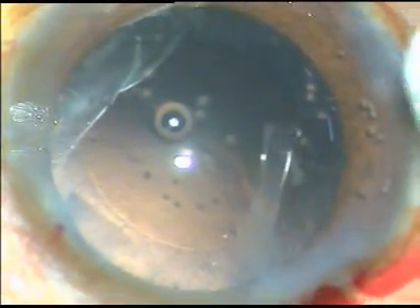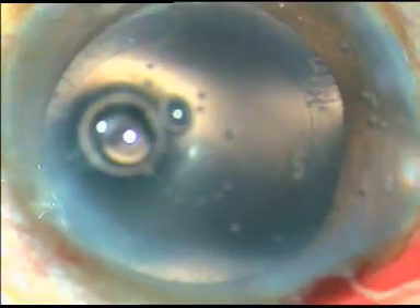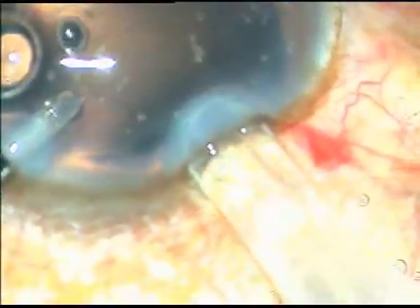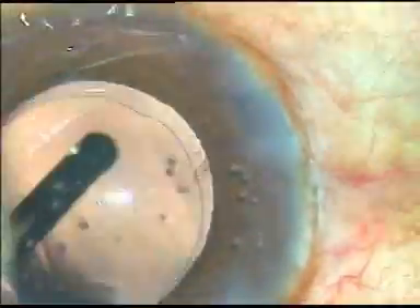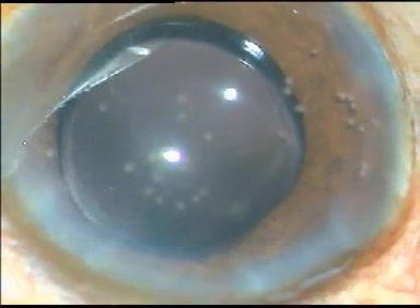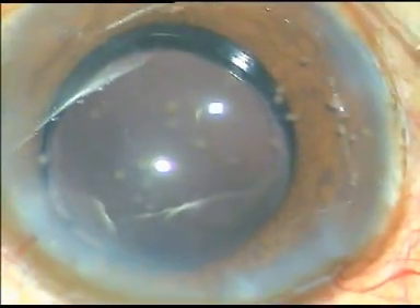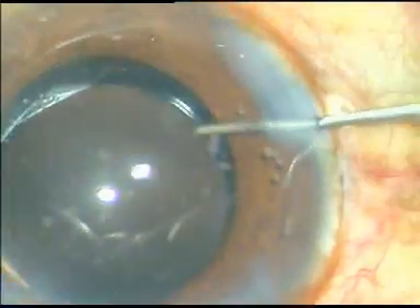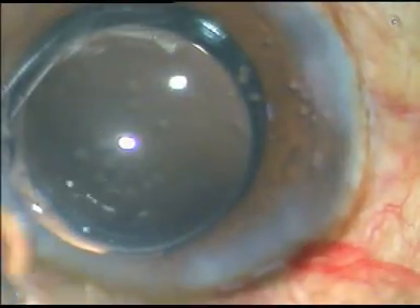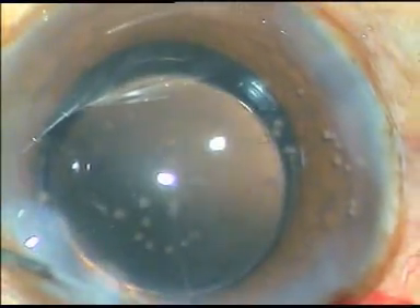Viscoelastic substance is not injected in this case. The IOL is being implanted under irrigation. This is a hydrophilic acrylic IOL made by Appasamy Associates, called NASPRO — a very beautiful aspheric lens. The side ports are hydrated, moxifloxacin is injected into the anterior chamber, and a final wash is given using balanced salt solution.